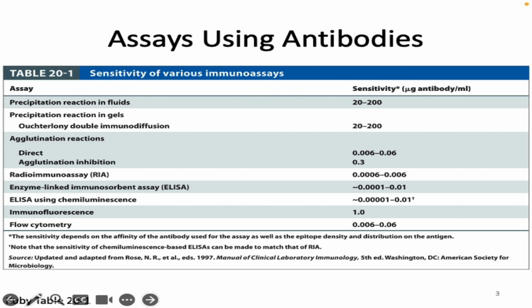So the antigen is only in the test if it was in your nose, because you're going to swab your nose and put it on there with some saline. And so if you have the virus, then now there is antigen. If you don't have the virus, then there's no antigen. Either way, there is something that binds a control. But in terms of the SARS-CoV-2, it's a question of was there SARS-CoV-2 in your nose? It's detecting whether the antigen is there to bind to the antibody that is on the paper.